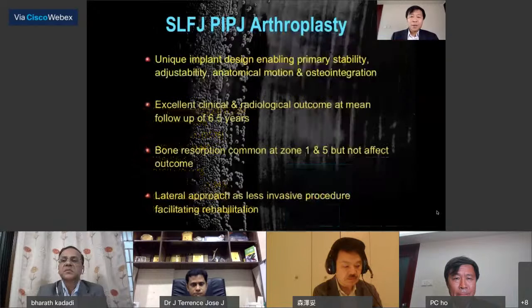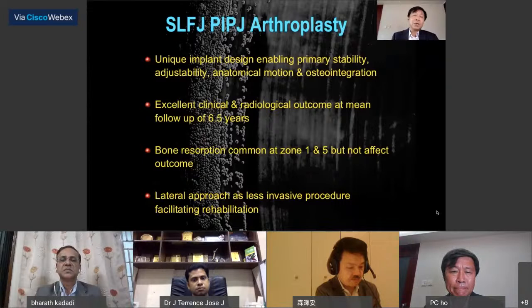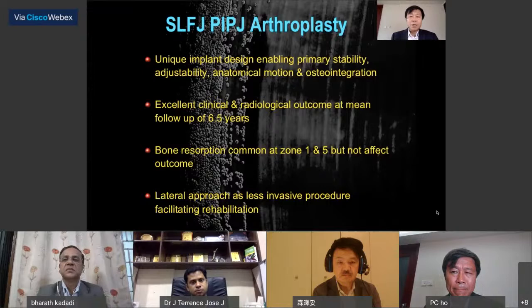So in summary, our experience in using the self-locking finger joint is still a happy experience. We appreciate the very good and unique implant design enabling primary stability, adjustability, anatomical motion and also osteointegration. We have excellent clinical and radiological outcomes at a mean of 6.5 years. We saw bone resorption in zone 1 and zone 5, but apparently it is not affecting the clinical outcome, so there may be some other compensatory mechanism to stabilize the implant.